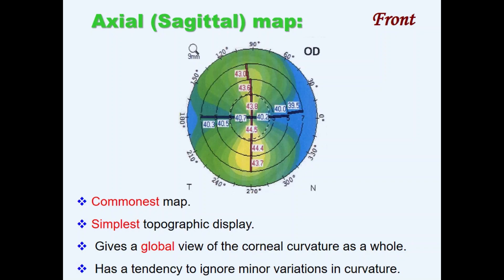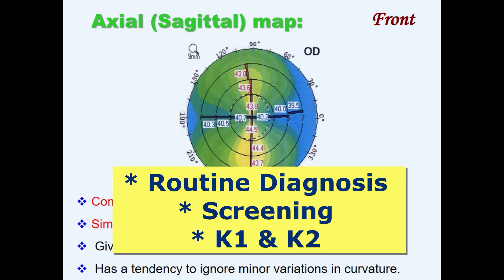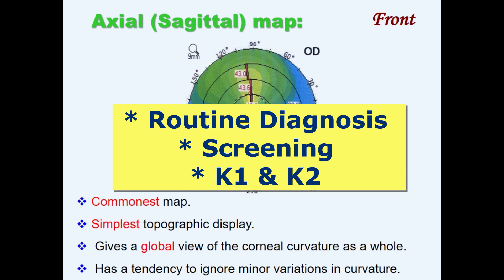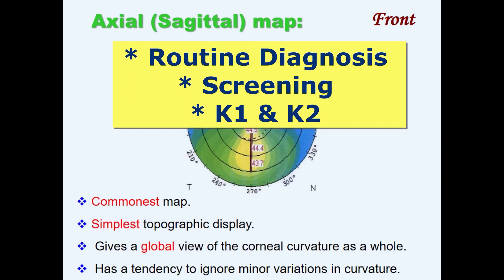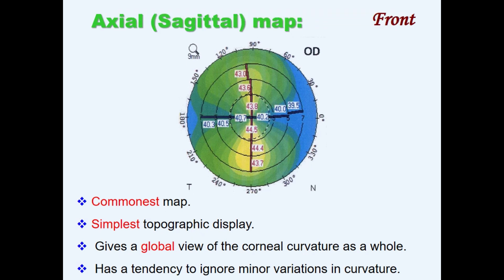Axial or sagittal map is the most commonly used one. It provides a good estimate of the overall corneal shape, which appears smooth with little noise because it provides an average of adjacent curvature values. Axial maps are the preferred clinical topographic default for routine diagnosis, screening for pathologists, IOL power calculation, and central corneal power measurement.